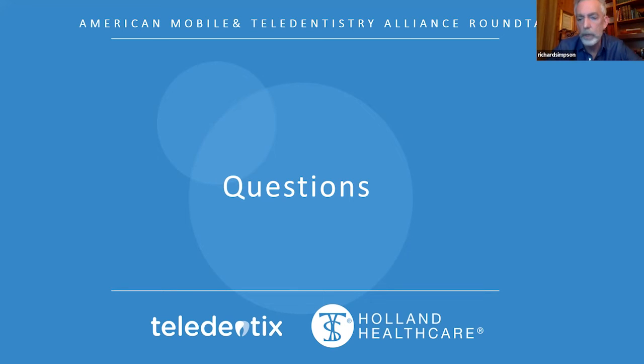The video is a really nice capture. You can start on one side, practice it first, retract the cheek, gently roll across. I think Daniel actually showed two quick videos there where you saw that it rolled around, did the whole survey of the lower arch, then you flip it and do a whole survey of the upper arch. In 10 seconds, you get a complete view of the full dentition. So a video is a nice way to capture all of that with fewer stills. And then you can actually take stills from the video, which is a nice way to go too.